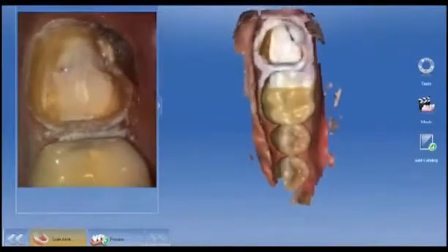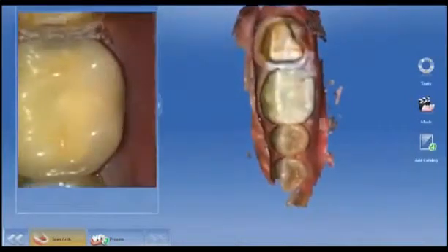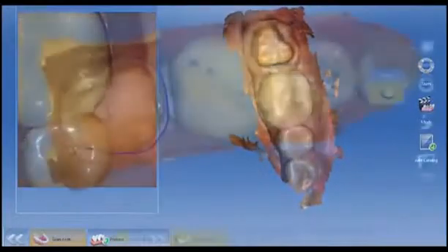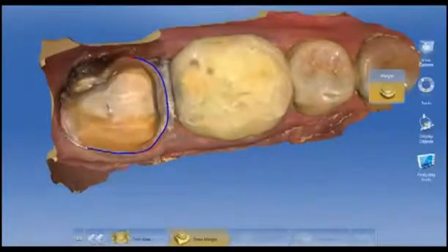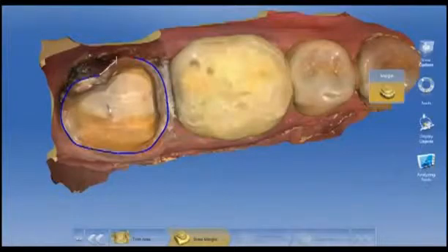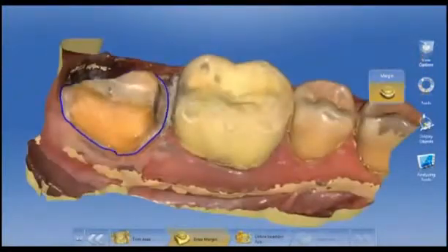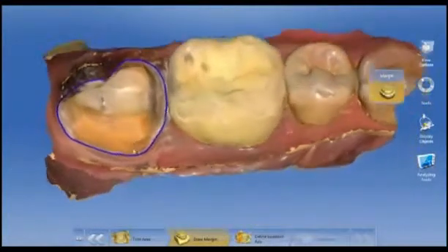Once we take the impression, all we have to do is define where the margin goes, and this is where CEREC and the Omnicam really shine. When you look at that concavity on the distal lingual where I put that margin, CEREC will mill down to it. But if I was going to put a matrix band in that area, it'd be a much more difficult area. I don't know if I could truly seal that with a nice contour. So we got our margin marked, and we're going to tell CEREC where the insertion axis is. Basically, we're defining the mesial and distal, and then we're going to run the calculation.